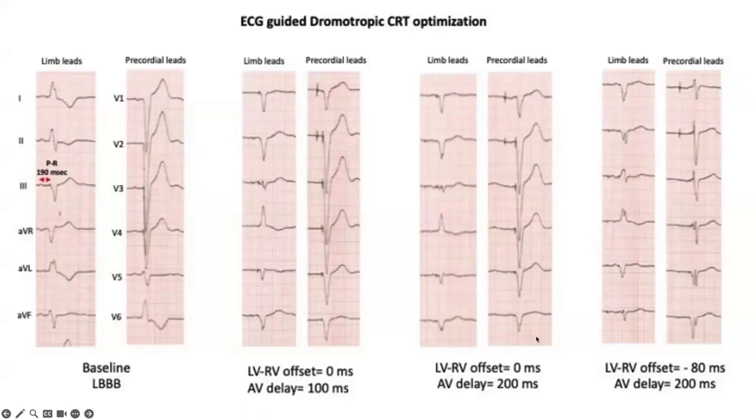And one thing to note here, obviously it's patient to patient. So this is the best programming for this specific patient. I would not just take this and do this for every single patient you see, because it could have a very much opposite effect. So it's really catering the device programming to the patient that you're seeing.